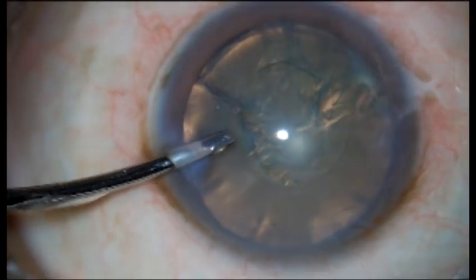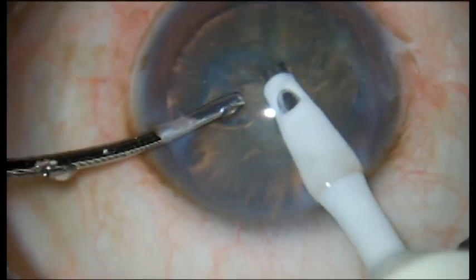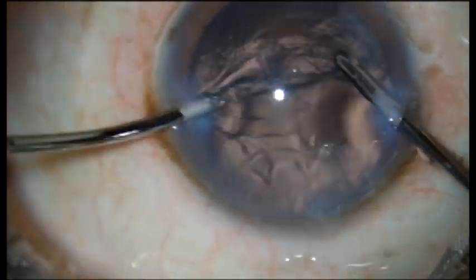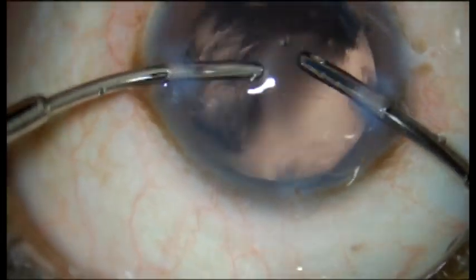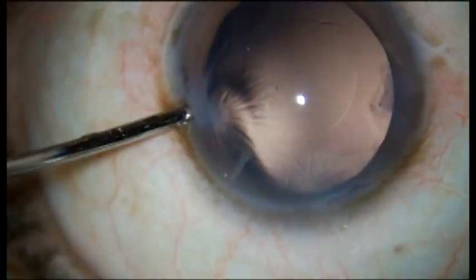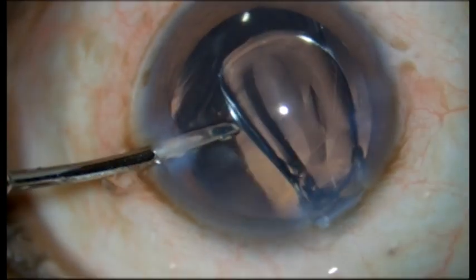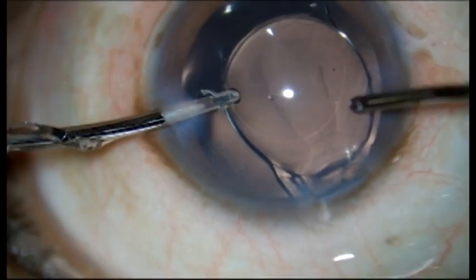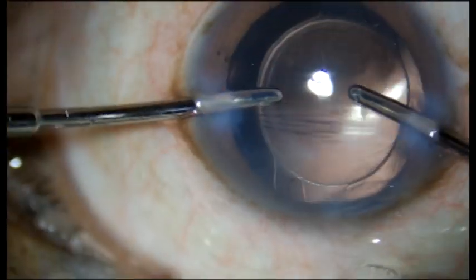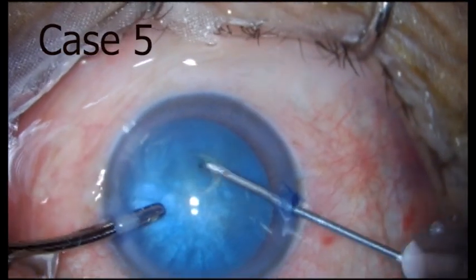a potentially risky procedure at the end of surgery, particularly when the pupil is small. This risk can be completely avoided. Fewer entries and exits from the anterior chamber make surgery much safer. Postoperatively, the risk of intraocular pressure rise due to retained viscoelastic and viscoelastic related issues can be completely avoided.